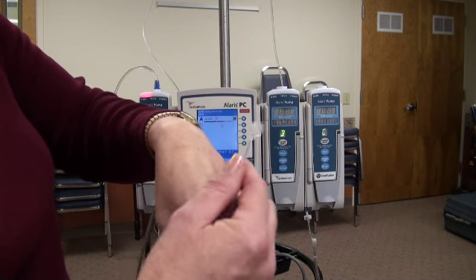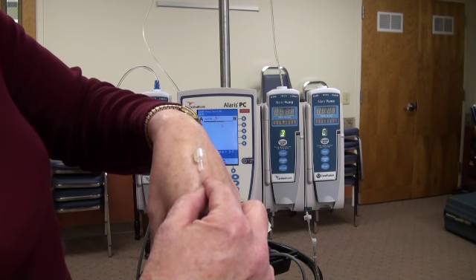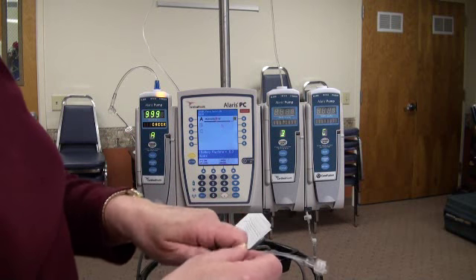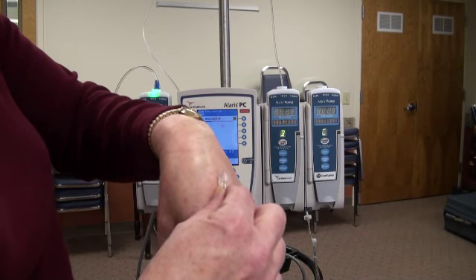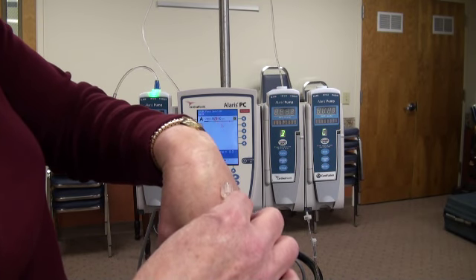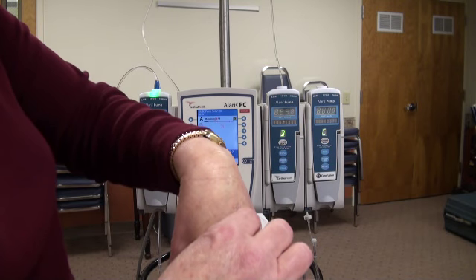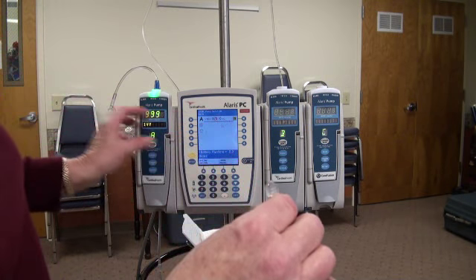Maybe it's what we call a touchy IV site. Maybe we need to pull back a little bit. You pull back a little bit, and it checks, and then it goes back to maintenance infusion. And we're like, well, that was weird. So start looking. Make sure that the site's good. Maybe their hand is just bent a little bit. You're going down the road just fine.